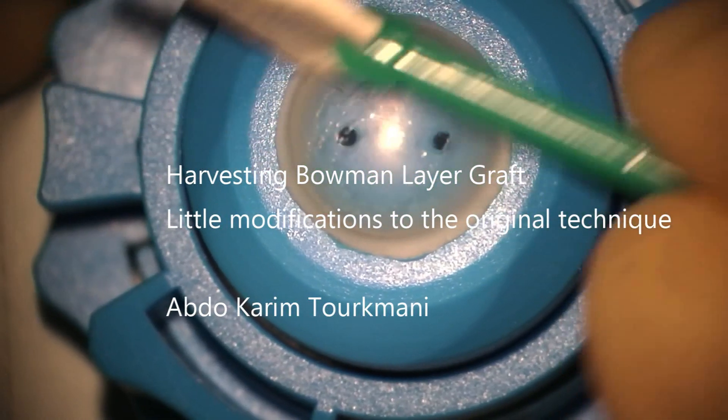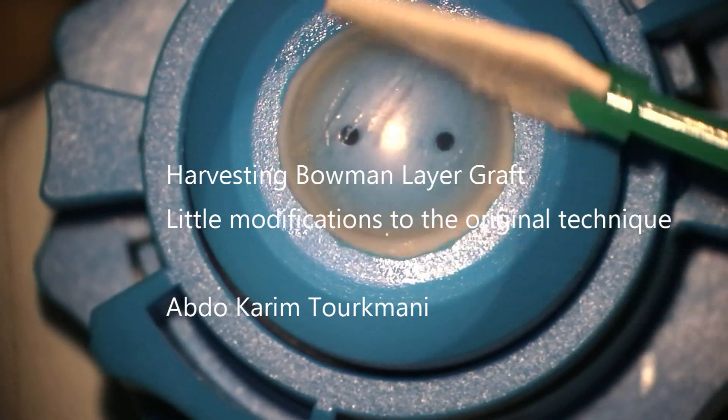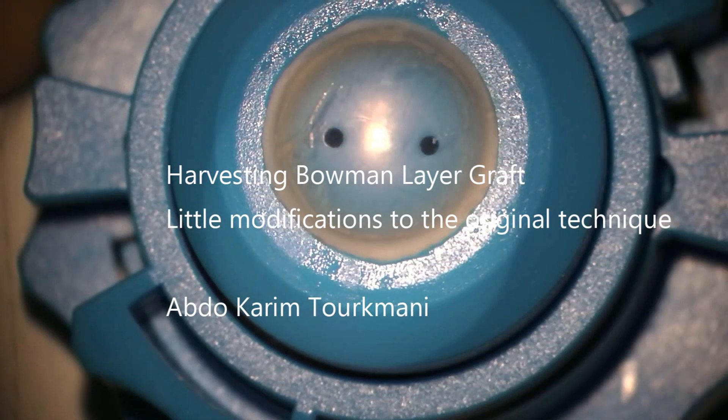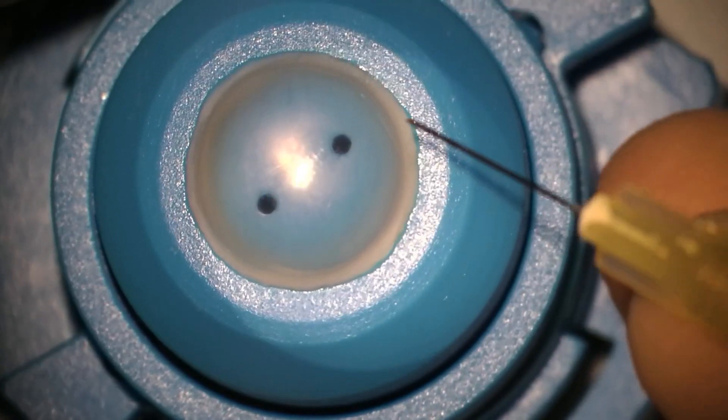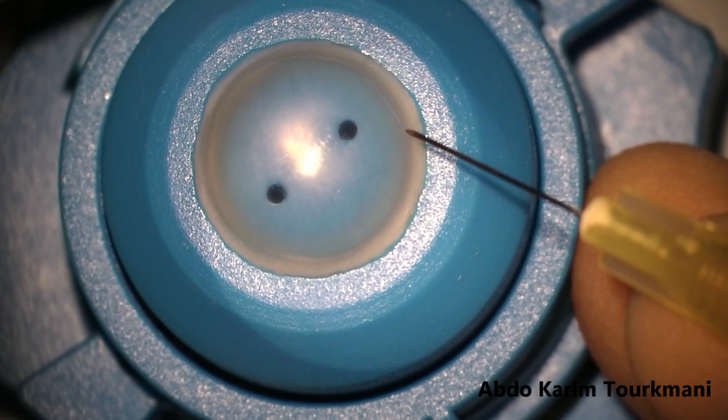Hello, this is Dr. Turkmani, consultant in cornea and cataract surgery, and in this video I'm going to present a few modifications that I do when harvesting a Bowman layer graft.